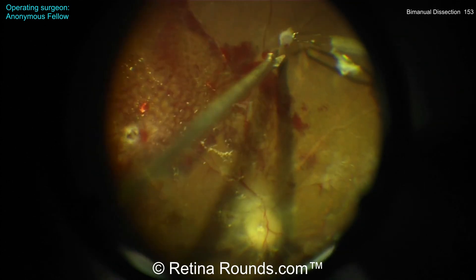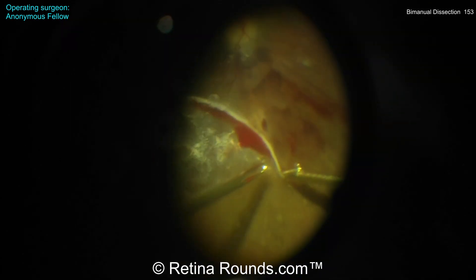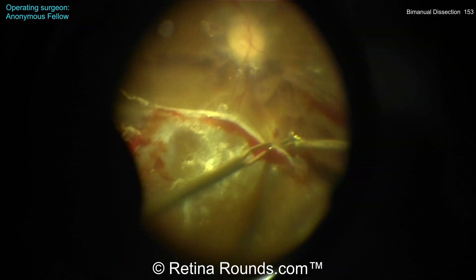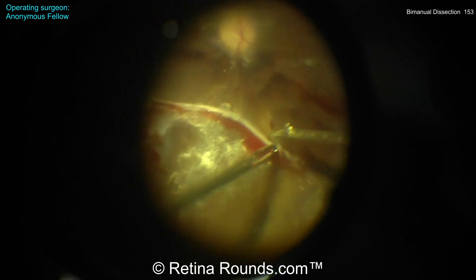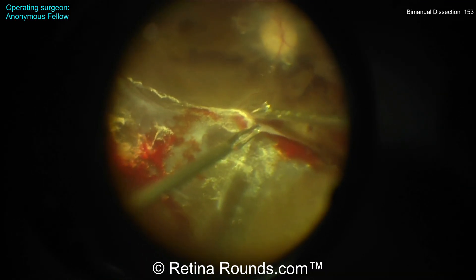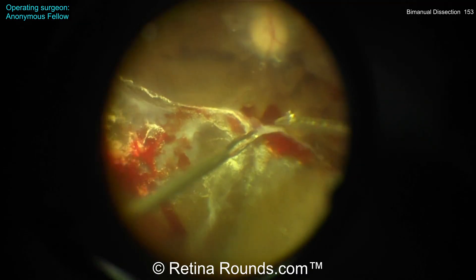The posterior surface of the eye is curved, and so these scissors are curved scissors. Going in a posterior-to-anterior approach can sometimes be more challenging. You do have to take a more vertical approach when going posterior-to-anterior, as opposed to an anterior-to-posterior approach where you can just follow the curvature of the globe, especially in the superior retina.